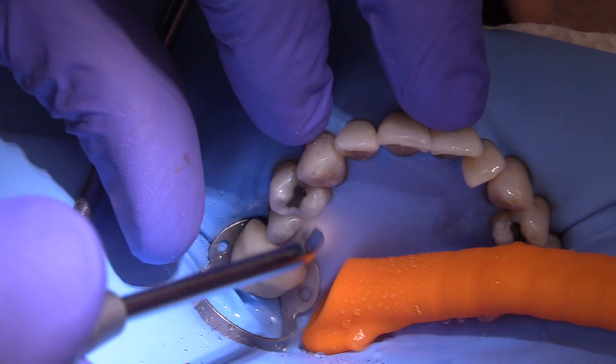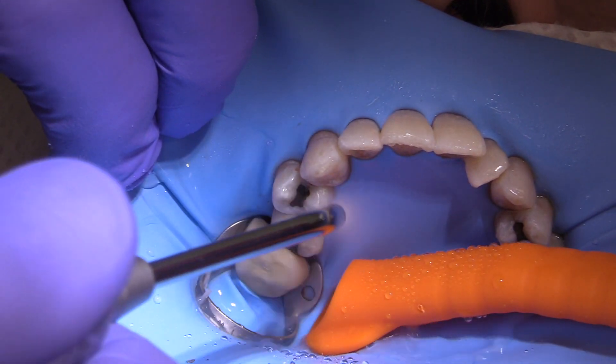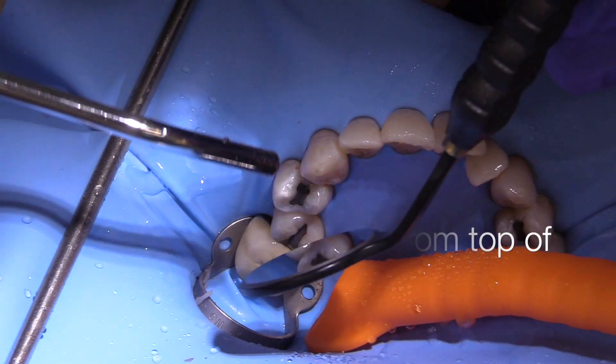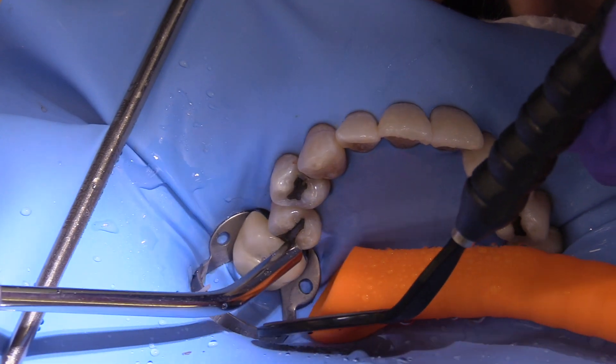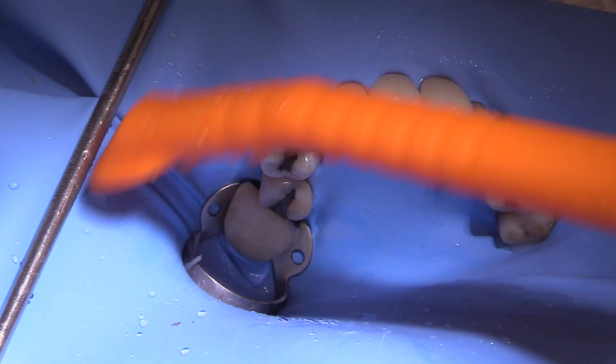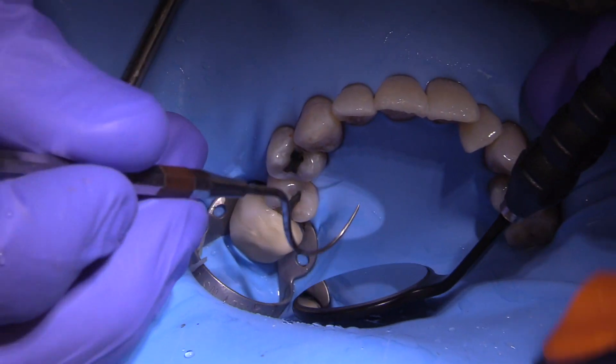You'll notice that the rubber dam was punched with the central incisors one inch from the top of the rubber dam. That way the rubber dam doesn't climb up over the nose and cover it, which facilitates more patient comfort and they won't have any problems breathing through their nose.